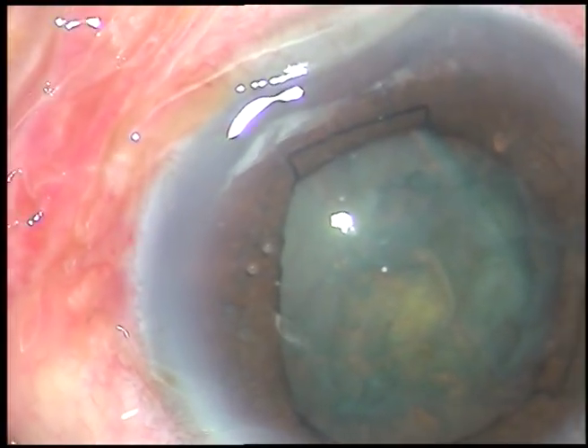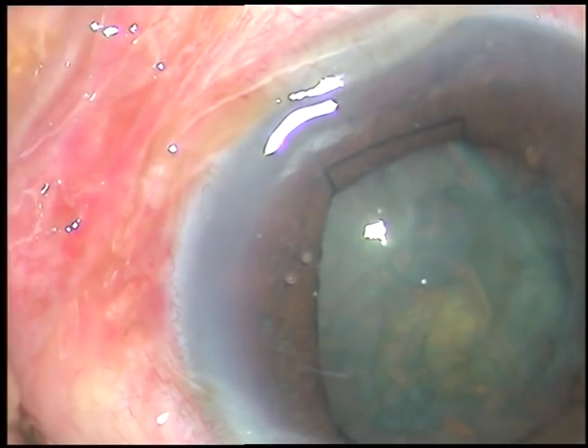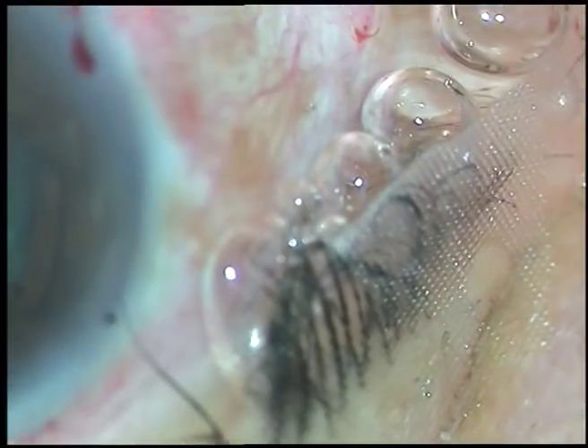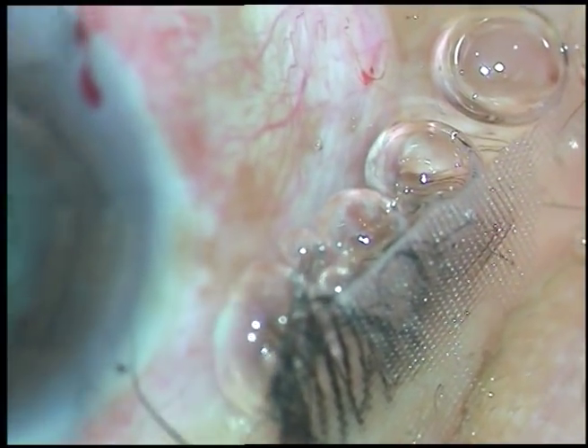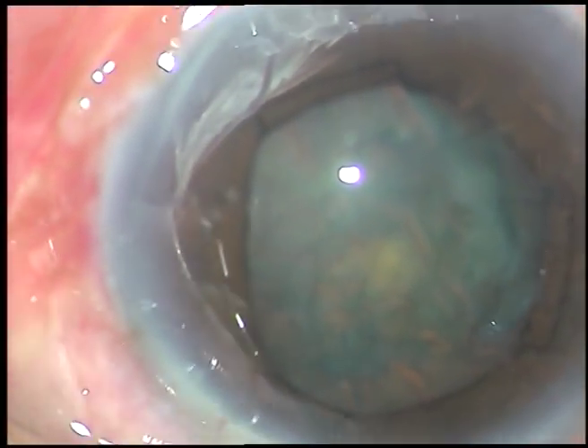Now I introduce the tip of the phaco handpiece bevel down. You can see that one flange has not been tucked properly — the flange at 2 o'clock has not been tucked properly. Still we have sufficient dilatation.